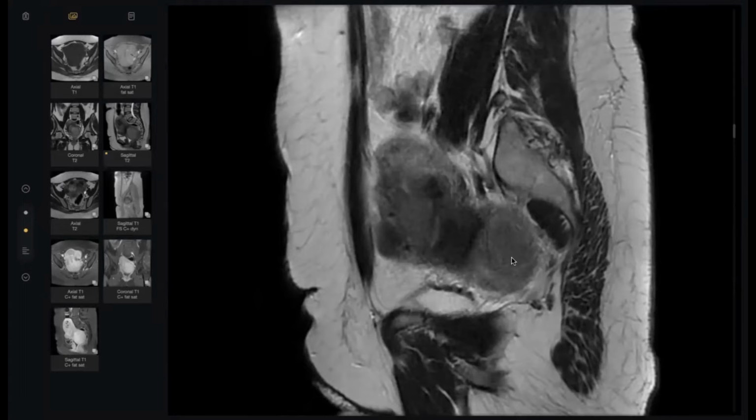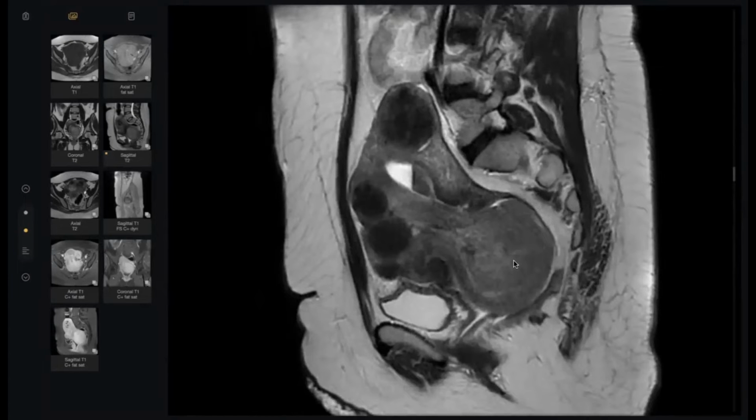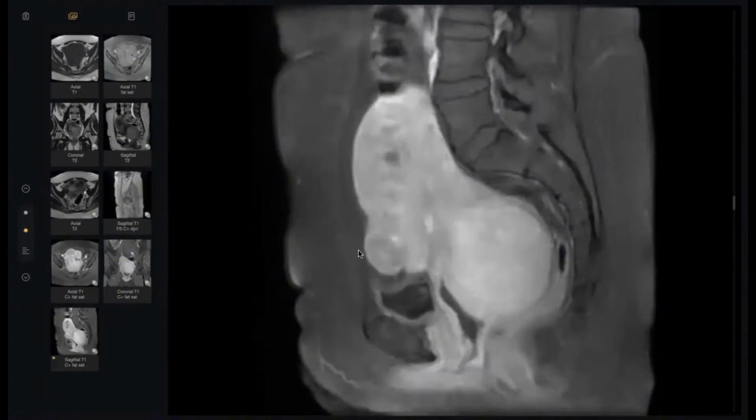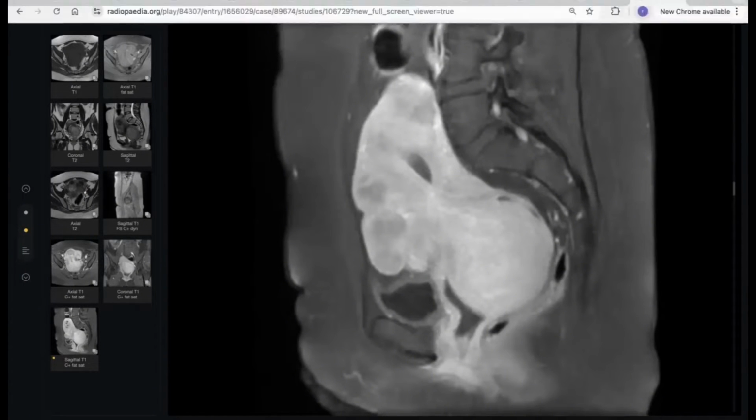This is a large endometrial polyp. How could we know it? Look here, the connection. And don't concentrate too much on this fluid. Some pretend fluid or blood, because there is a fluid level, but the fruit is here. See, the origin from here, and it has an enhanced vascular pedicle. Typical of an endometrial polyp, but atypical size. This is the vagina, by the way. Okay. Thank you, doctor, so much.